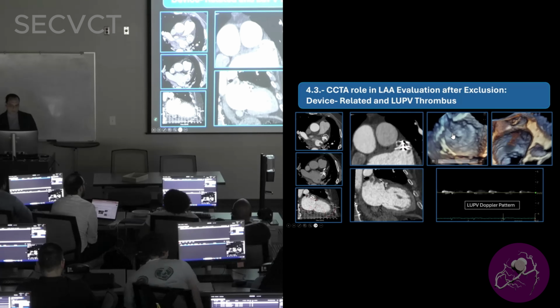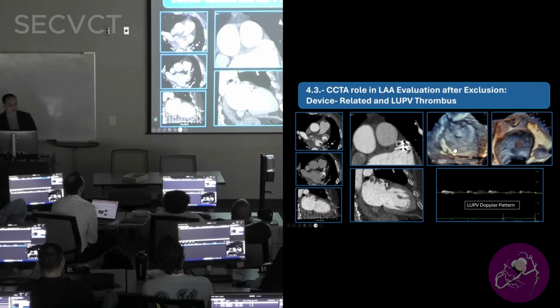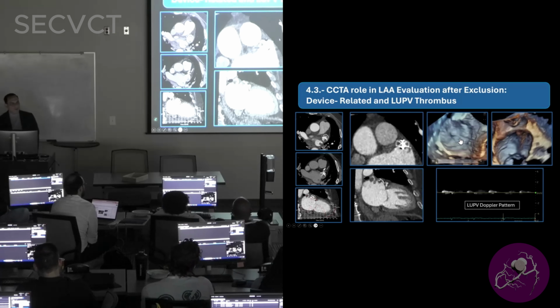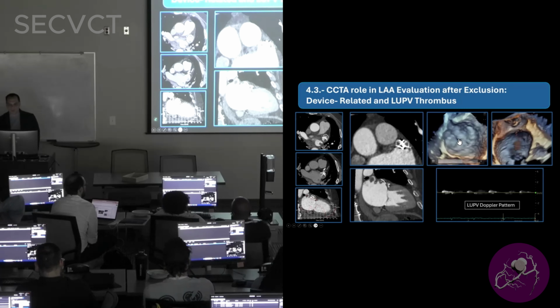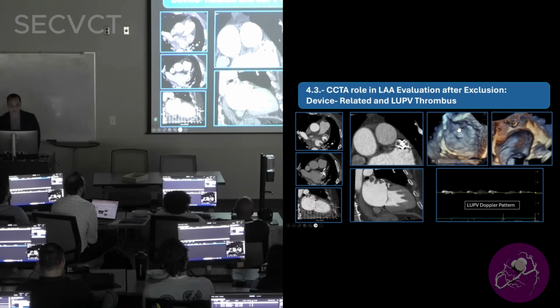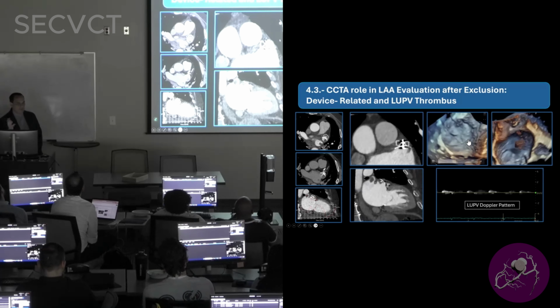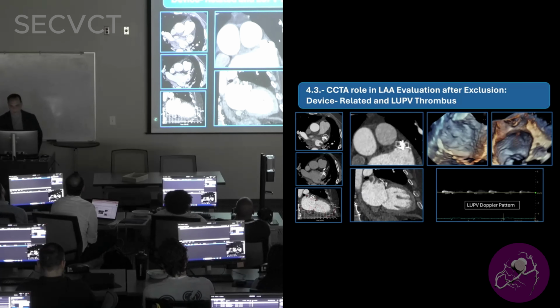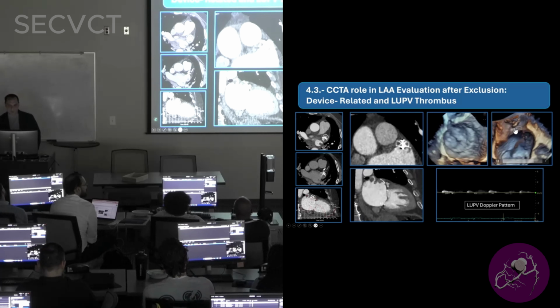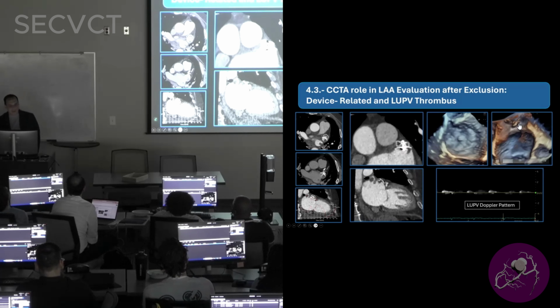After some time, we had to do a TE for this patient, and this is my TE. And just to prove how easily you can miss this, unless you really know how to play with the knobology of your machine when you're doing these reconstructions and you know how to optimize your image, this may look okay to you, and you may be missing that there's potentially a lot of thickening. And unless you know when to go for the left superior vein and whatnot, this may easily be missed as well.